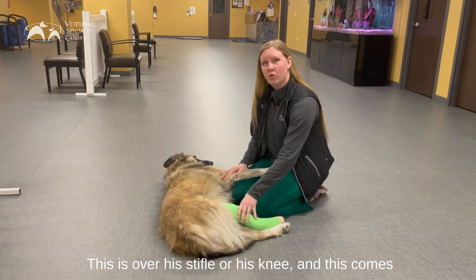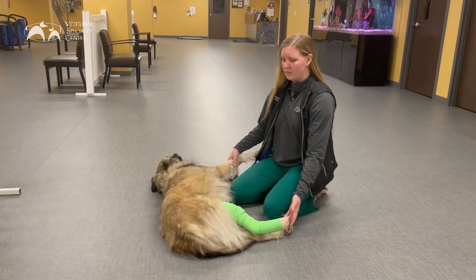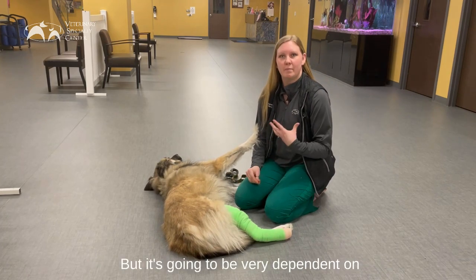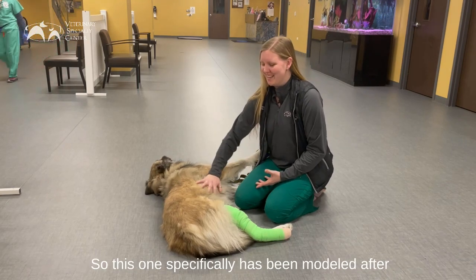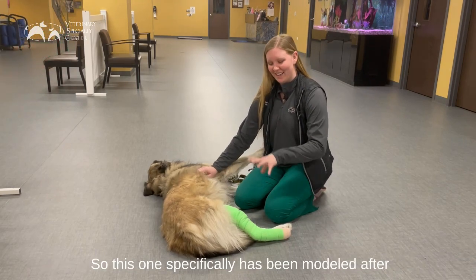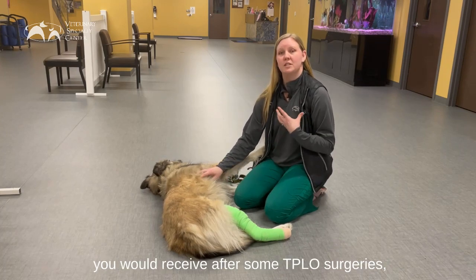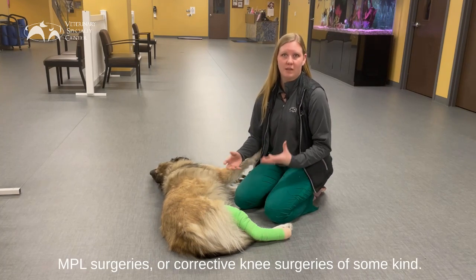This is over his stifle or his knee, and this comes down all the way to the tip of his toes. Most often we'll send these home with the instruction to remove in something like 72 hours, but it's going to be very dependent on your specific pet, their issues, and their doctor's recommendation. This one specifically has been modeled after a 72-hour compression bandage similar to what you would receive after some TPLO surgeries, MPL surgeries, or corrective knee surgeries of some kind.